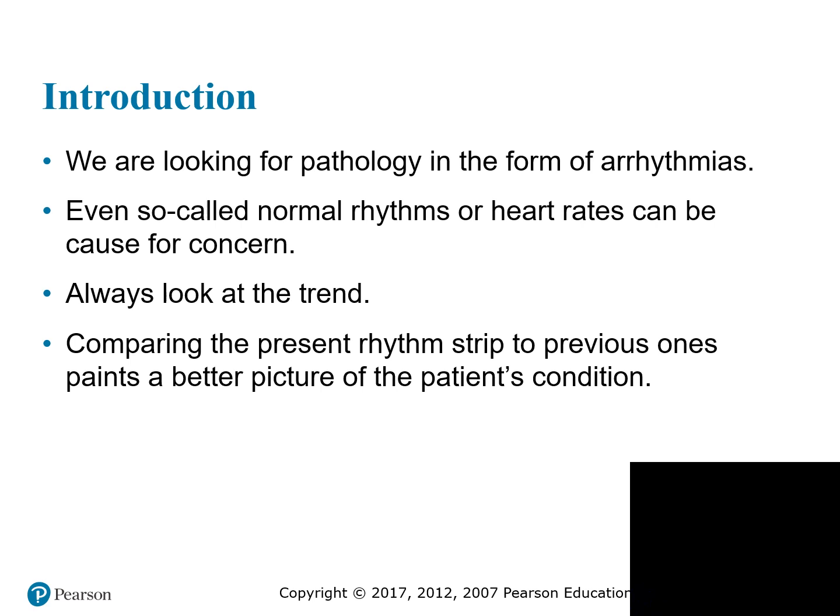Comparing the present rhythm strip to any previous rhythm strips paints a better picture of what the patient's condition is. This is the whole reason why it's very important to learn how to interpret rhythm strips. Especially when we have someone who has had a previous heart attack, or maybe they just had some mild heart palpitations, we need to know how to compare their EKG strips from the previous one, when they had the problem, to possibly a current one to see if there are any changes that have happened.